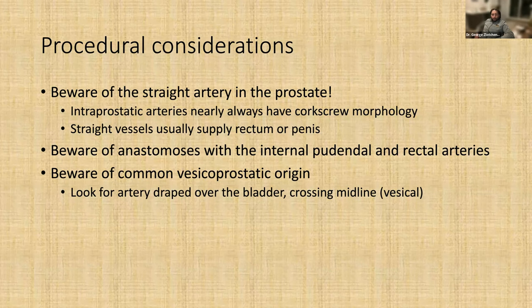All right, some more procedural considerations. Be wary of the straight artery in the prostate. They should usually have a corkscrew appearance. Straight vessels usually supply the rectum or penis. You don't want to embolize those. Beware of anastomosis with the internal pudendal and rectal arteries. Again, don't want to embolize those arteries.